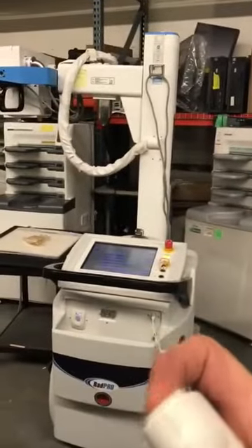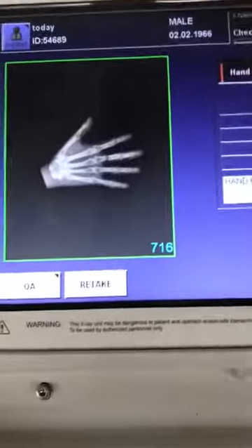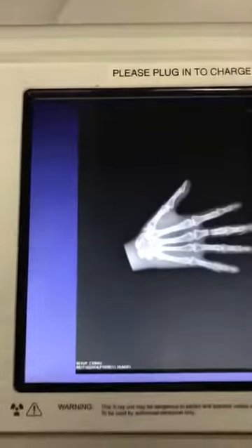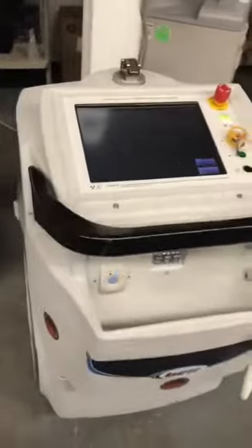I'll hit the switch and walk right back up to it — and there's our hand, a nice looking image. There's an external network cable here to send to your PACS system — everything you need in one. Any questions, we can help you out. Thank you.